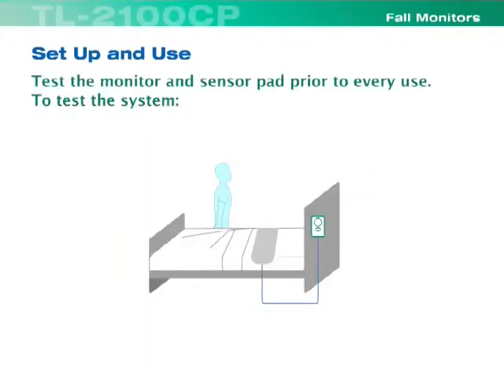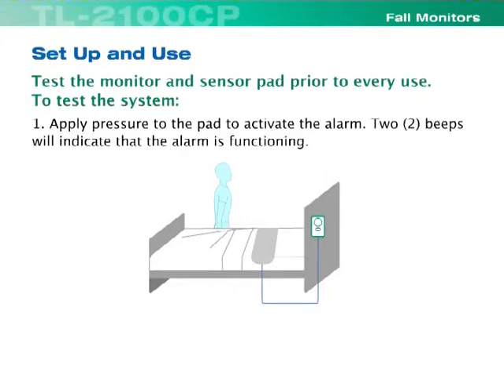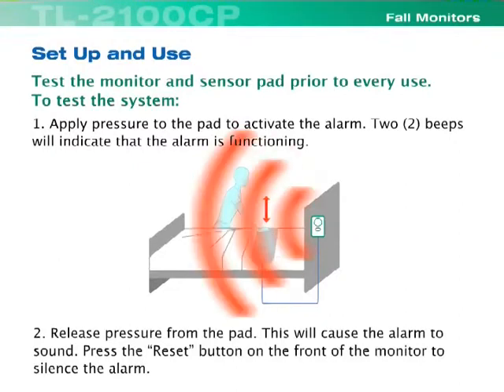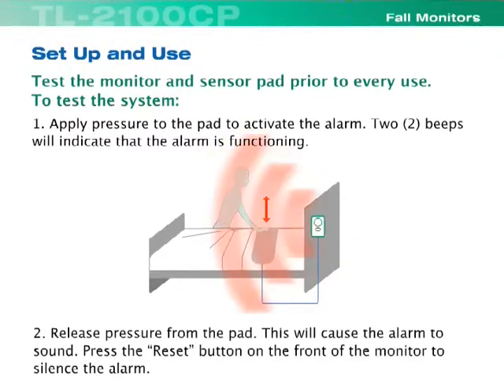Test the monitor and sensor pad prior to every use. To test the system, apply pressure to the pad to activate the alarm — two beeps will indicate that the alarm is functioning. Release pressure from the pad; this will cause the alarm to sound. Press the reset button on the front of the monitor to silence the alarm.